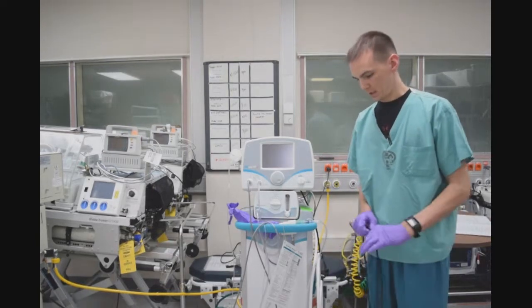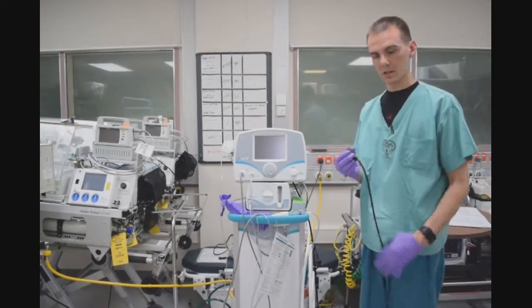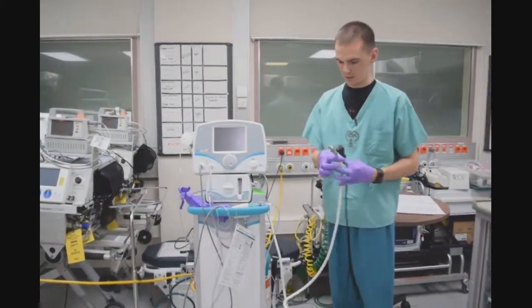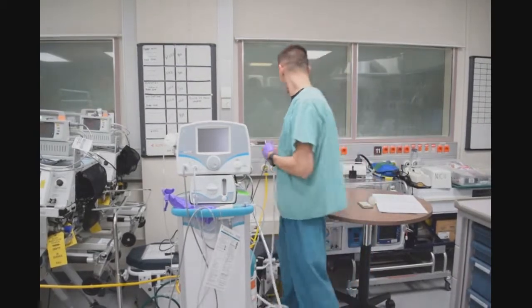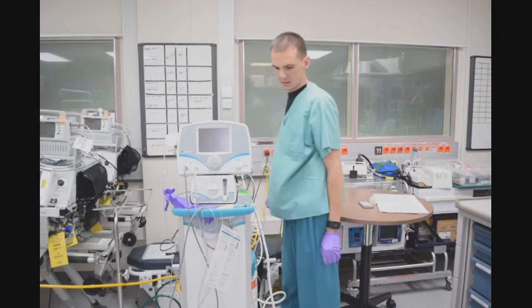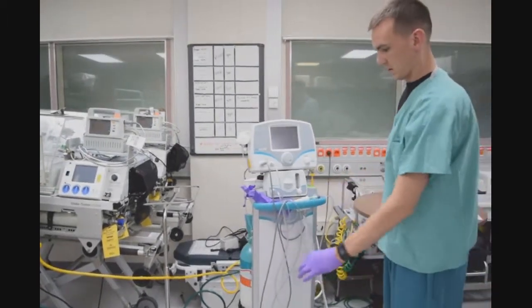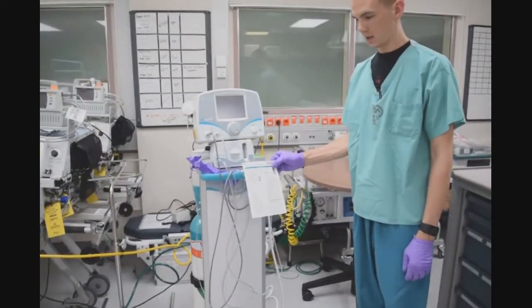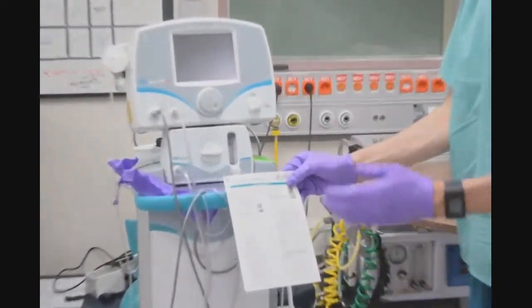The first step to conduct calibration: I will plug in the power cord and the oxygen line. From here, I will follow the quick reference card located on the front of the INLMAX.